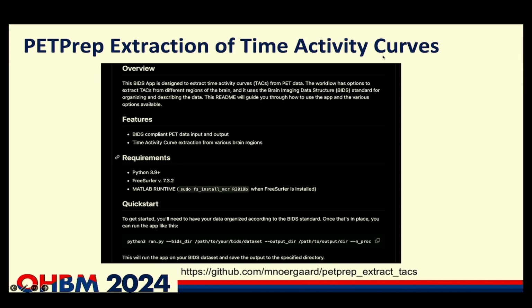The way that it can be executed is also as a BIDS application. So following motion correction, you can again run it just as a Python script here, as a BIDS application, giving it your input and also the output here. And then it will run the workflow, and you will get the outputs that you expect.